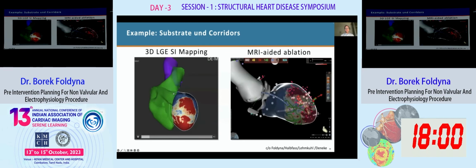So these are our 3D images. And you can see the layers I talked about, going from endocardial to epicardial. Let's stop and scroll through. I'm going to show you, for example, here is this large corridor connecting the healthy part of the ventricle here and the healthy part of the ventricle here.